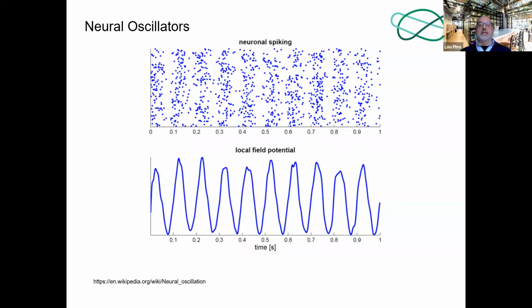Note that the strength of the voltage field is a summation of the individual neurons firing. If the pattern of firing neurons is more scattered, then the amplitude of the summed action potentials becomes weaker, and these peaks and valleys will diminish in strength.